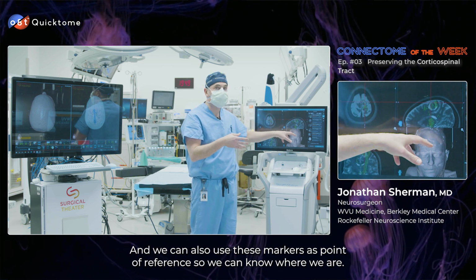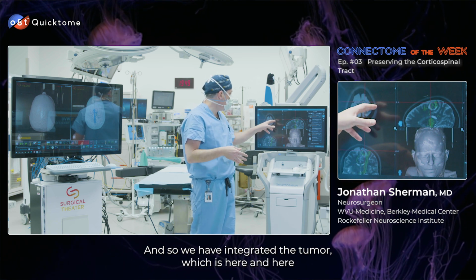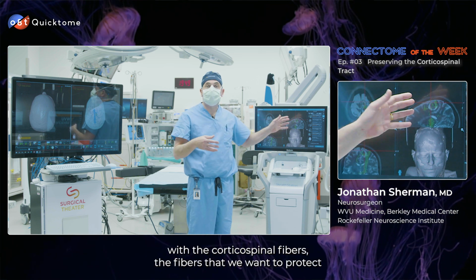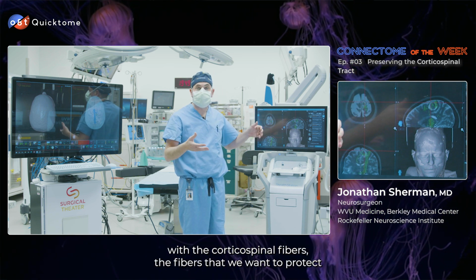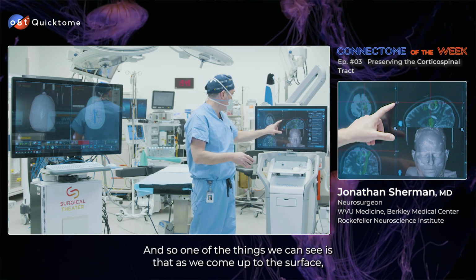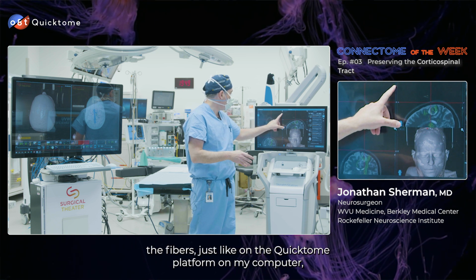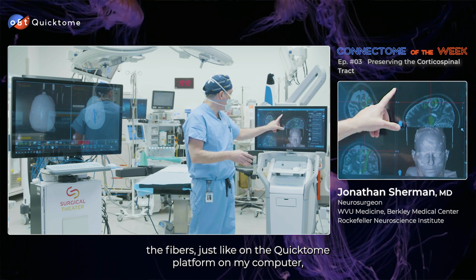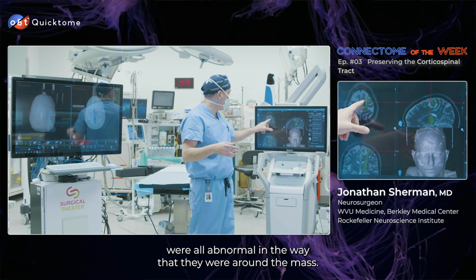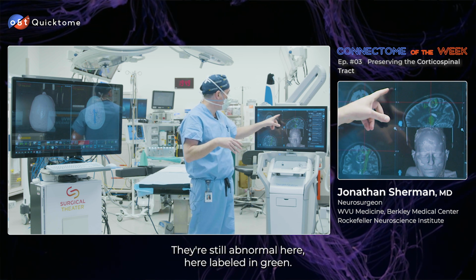And we can also use these markers as a point of reference so we can know where we are. And so we have integrated the tumor, which is here and here, with the corticospinal fibers, the fibers that we want to protect, and also we want to find our way in. And so one of the things we can see is that as we come up to the surface, the fibers, just like on the Quicktome platform on my computer, were all abnormal in the way that they were around the mass. They're still abnormal here, labeled in green.